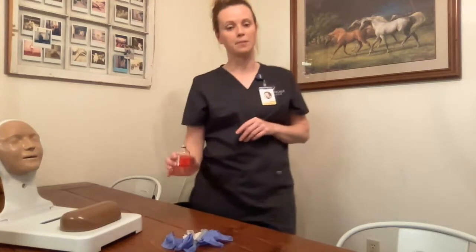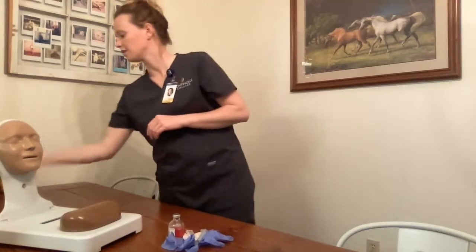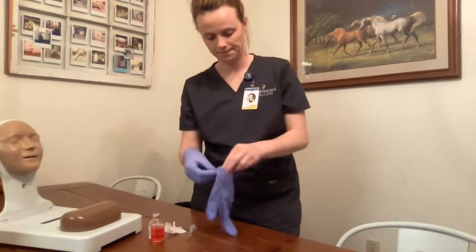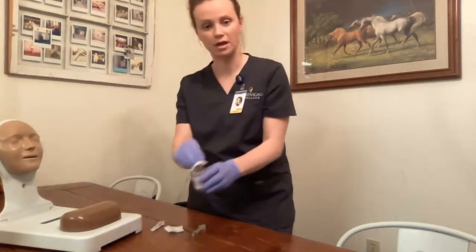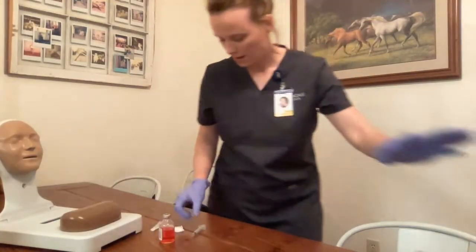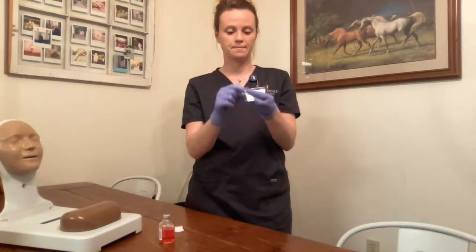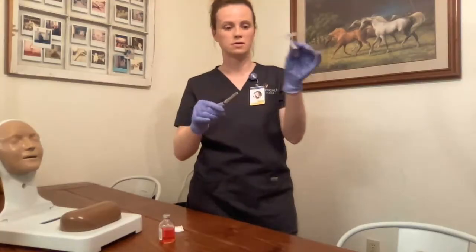At this point, I verify the medication against the MAR for my third and last time. I then perform hand hygiene and prepare the medication. I put on gloves, clean the top of my medication vial, dispose of the wipe, and attach my needle to my syringe — a 3 milliliter syringe and 22 gauge 1 inch needle. Just twist it on the end and dispose of the packaging.